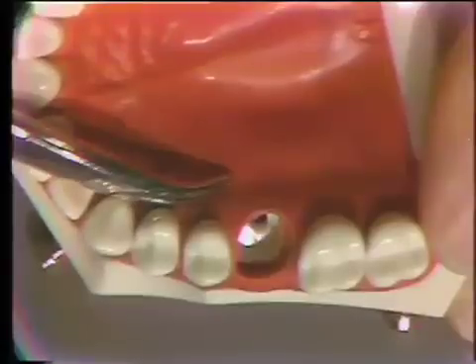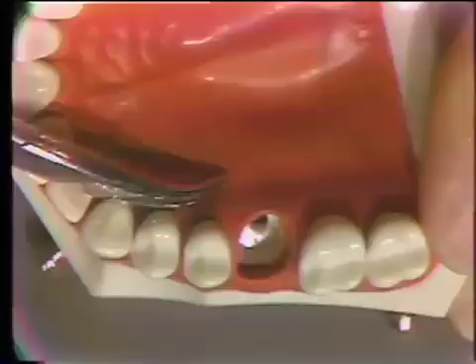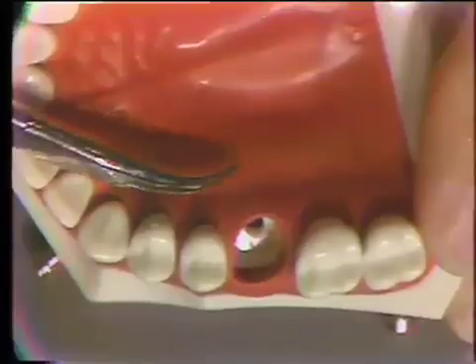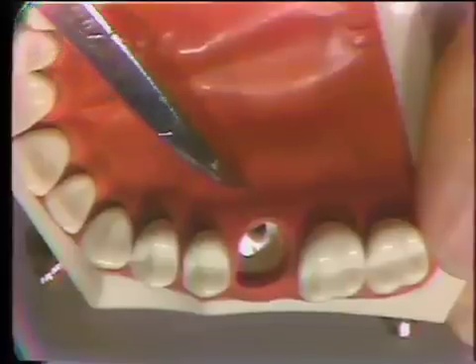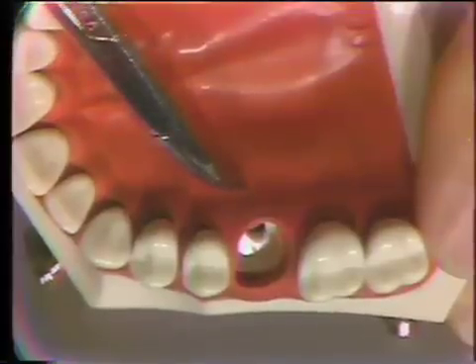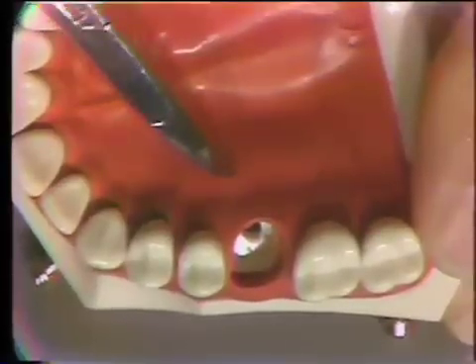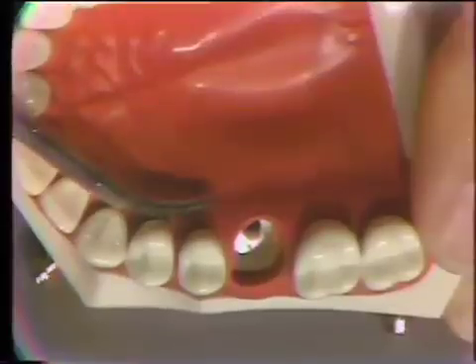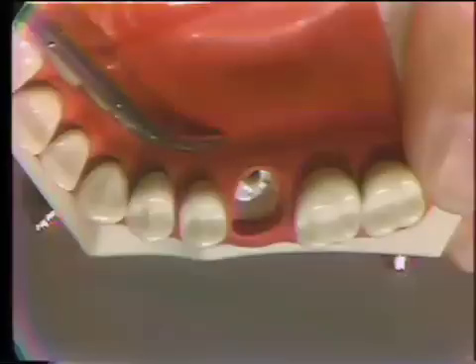The small capillaries for most soft tissue wounds are usually too small. It is only arterial bleeding that is generally amenable to the use of a hemostat. You can then clamp that and follow it with more pressure through the application of ligatures — sutures tied around the hemostat, or a needle passed as a so-called stick tie, to establish control of a major arterial bleed.